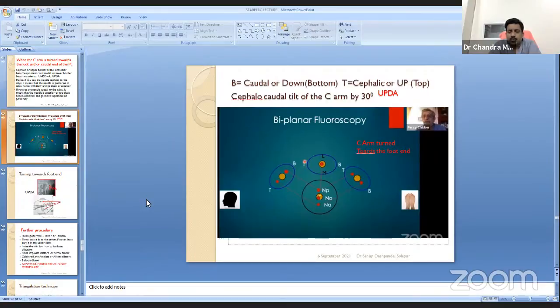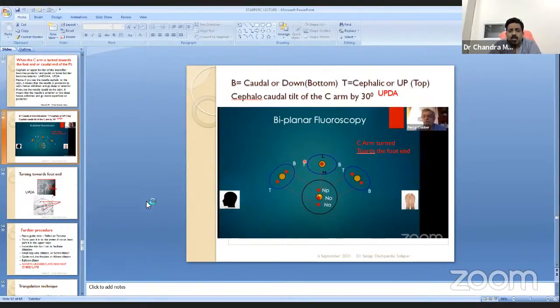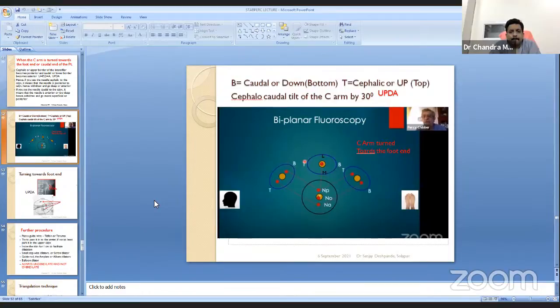Next question. In the inferior calyx and superior calyx, there is no anterior and posterior, more or less they are compound calyces. So when you aim at such a calyx, I think if you reach the most lateral part of the calyx, it is sufficient. Do you agree, sir? How do you approach the lower calyx where there is no anterior or posterior? It is like a round globe. When I'm in doubt, I inject a little bit of air, and suddenly a calyx which was not seen before pops up. Then we start thinking, this was not seen at all before when I put the dye. Very good. So you inject air in doubtful cases, and wherever the contrast gets diluted as a white dot, you puncture. Correct. This is my second question.